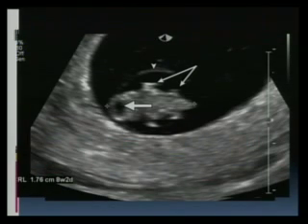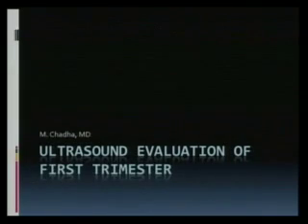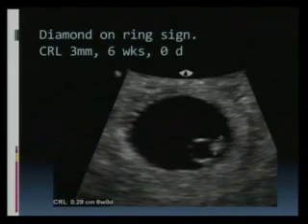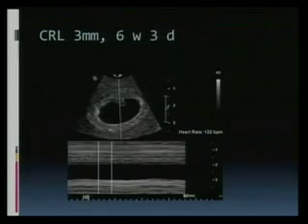So 4 things happening: segmentation of head with body, rhombencephalon, limb buds, and amnion, all occurring at 8 weeks. Everybody's with me? 8 weeks, head curvature separates, limb buds. 8 weeks, intrinsic motion. 8 weeks, rhombencephalon. Everybody's with me? Now I will transition after this slide to abnormal. We'll do as much as we can.